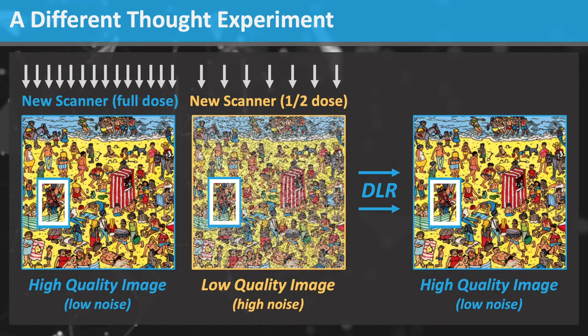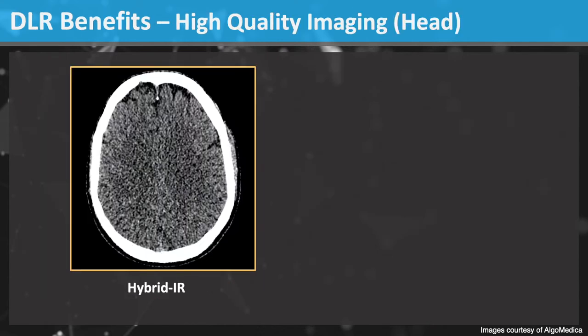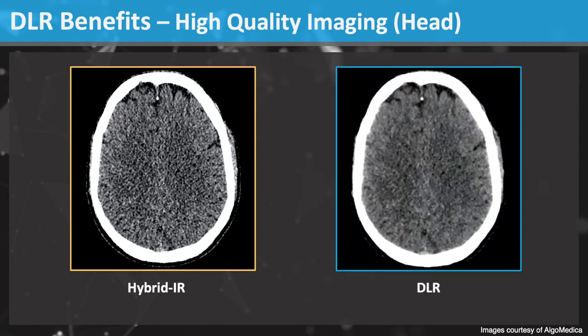Let's look at some real life CT images and examples. DLR can be used to improve CT image quality. This head CT has high image noise, despite using hybrid iterative reconstruction. DLR reduces the image noise and improves image quality.